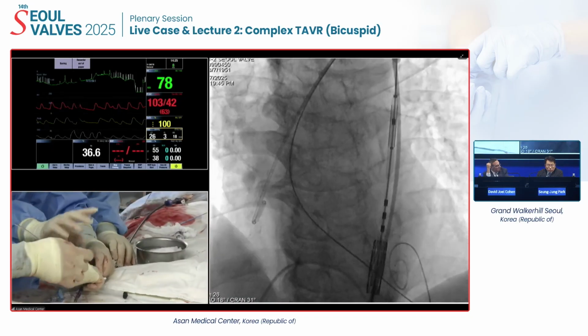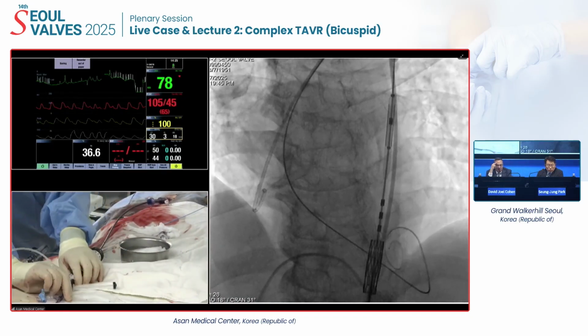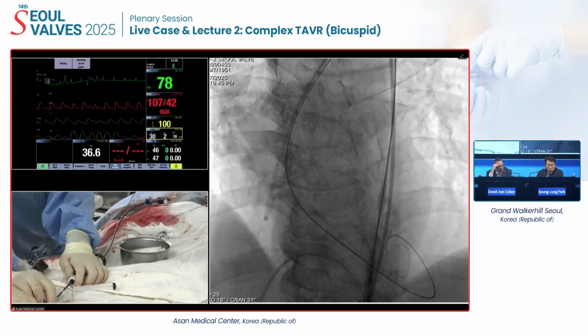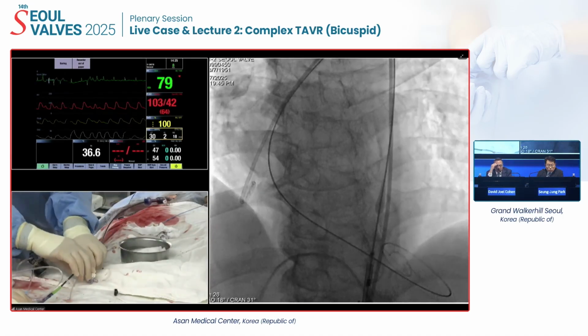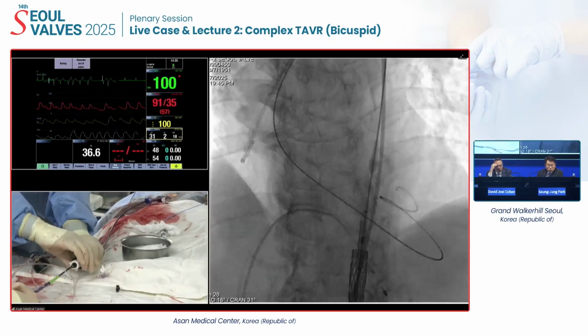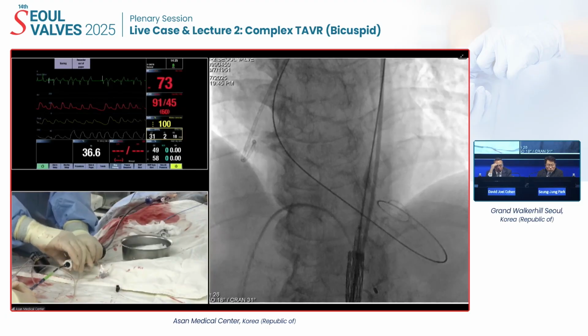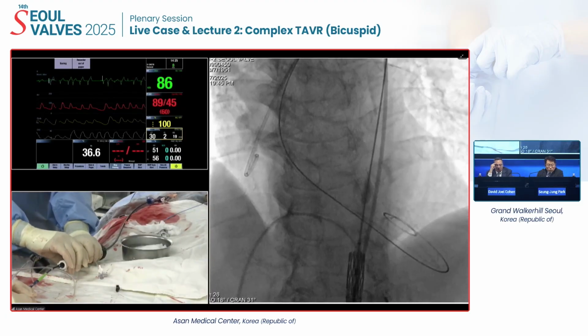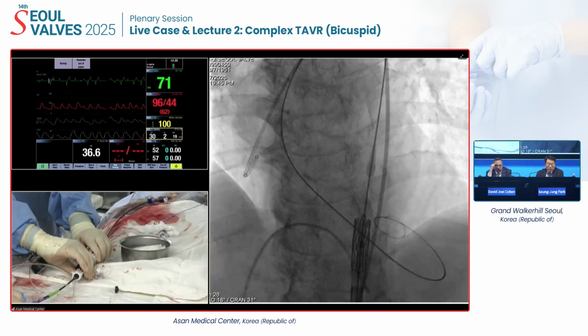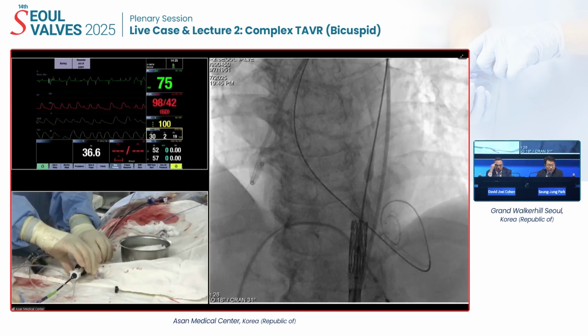Nope. You can, obviously. It works just fine, and you can use it the same way as with the self-expanding valve. You can control the depth perfectly. But obviously, we're all very experienced with doing it in the three-cusp view. It makes it very familiar looking.